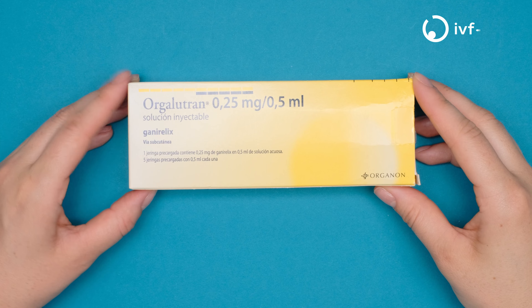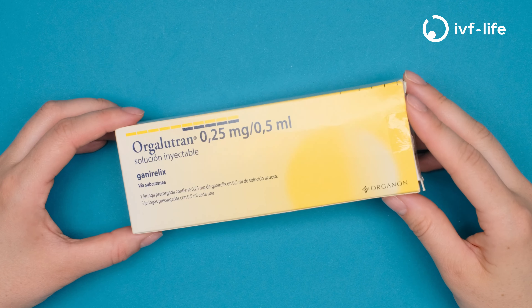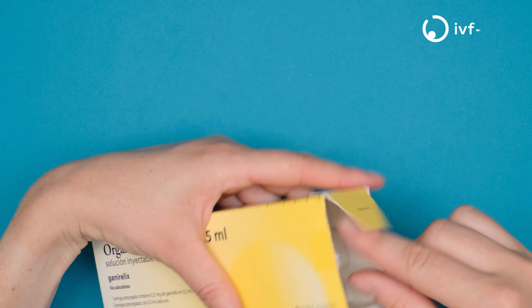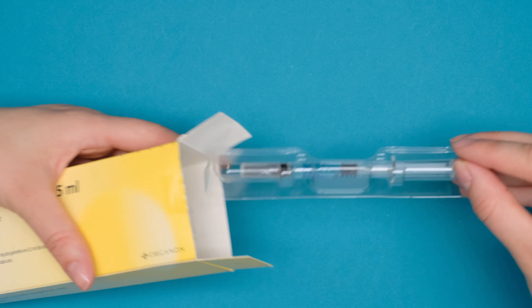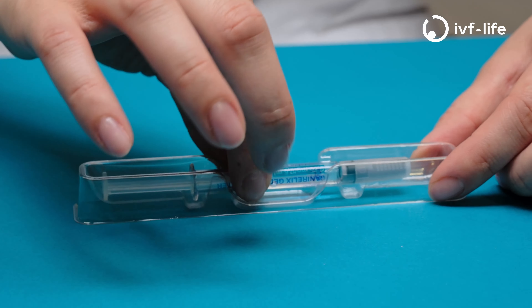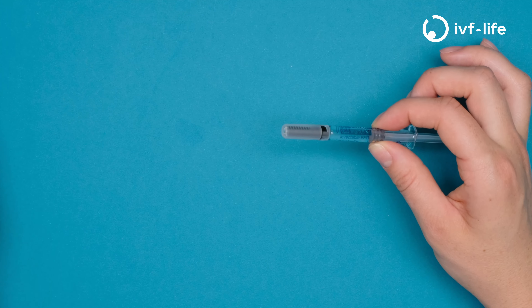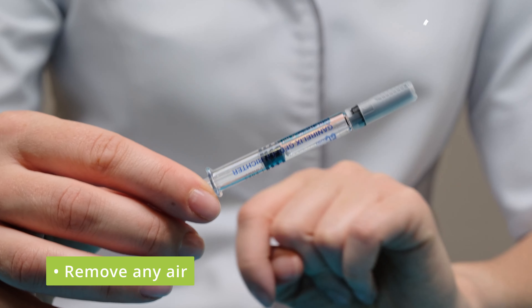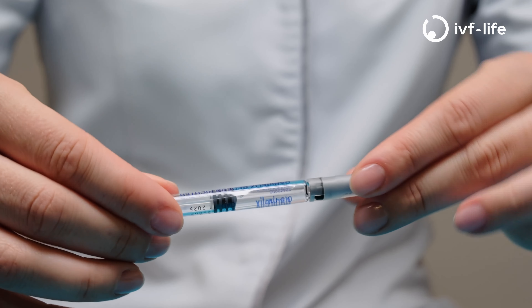This is how to administer olgalutron. In each box there normally comes five pre-filled syringes. Take one of the syringes and remove it from the plastic packaging. Just make sure that there's no air present, and if there is, you can push the plunger slightly to remove the air.